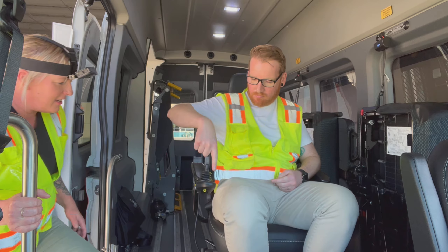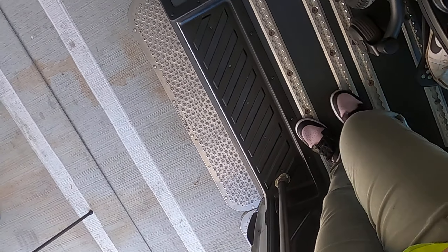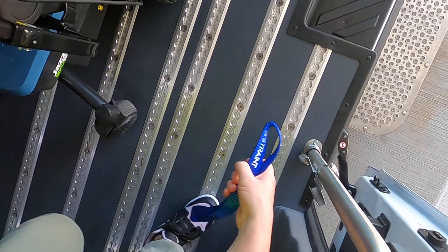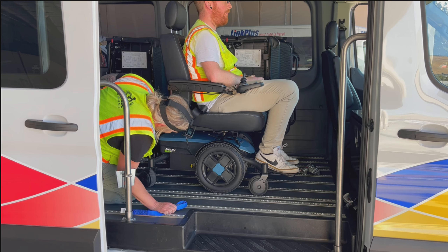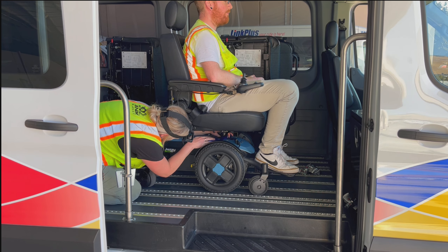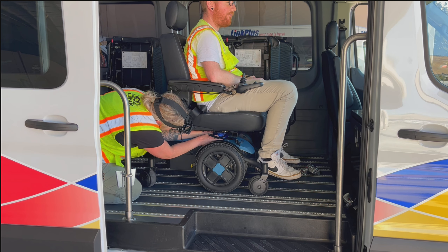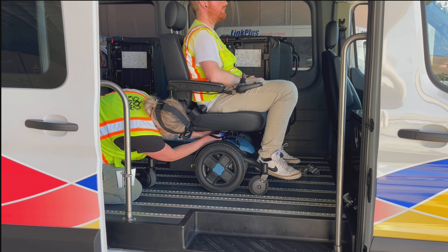I inspected his chair as he was riding up the lift and noticed there aren't any good securement points in the front, so I'm going to use a blue webbing loop. Basically, you loop it around the middle pole and push one loop through the other. It's a little tricky sometimes, but it sure helps.